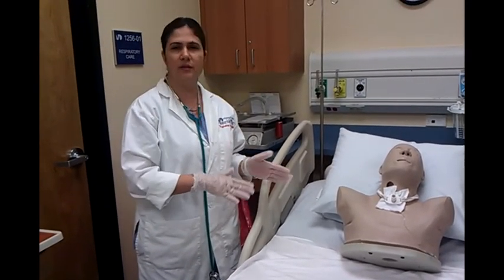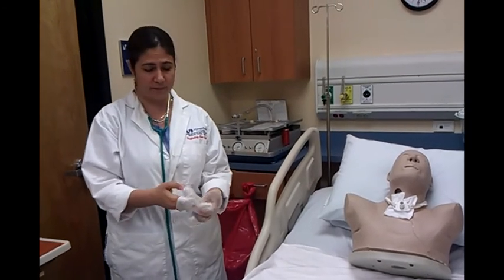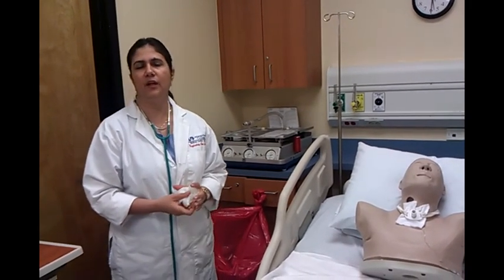I'm going to tell him somebody is coming to check on him later on. I'm going to remove my gloves, wash my hands, and go outside to chart everything I was doing today. Thank you so much. This is the way we do trachea care for the patient.